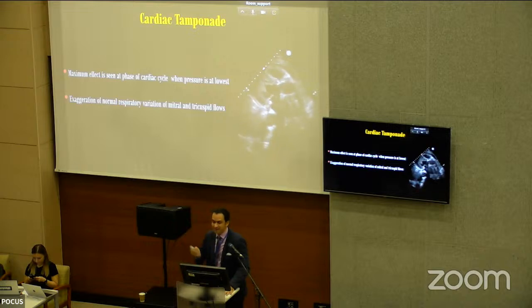As you can see, it is behind the descending aorta. So actually, this is mainly pleural effusion posterior to the heart. But what you can see anteriorly is clearly pericardial effusion. And that's the best view to differentiate both.